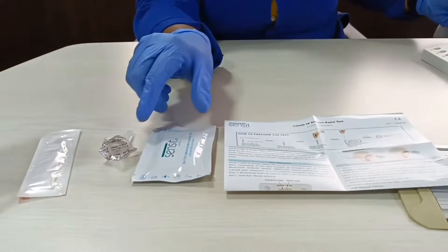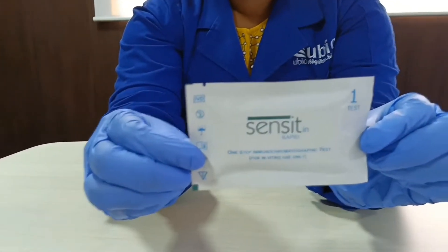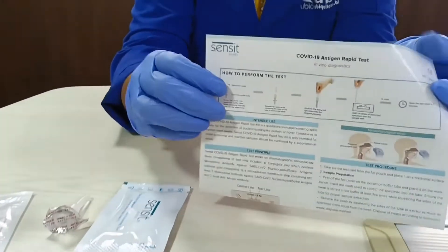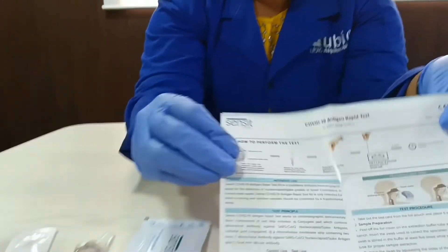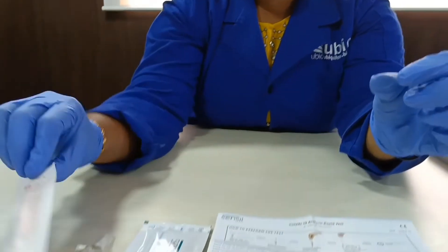The self use kit consists of a mono pouch with test device and a dropper. Instruction for use, mono pouch swab, and a buffer tube.